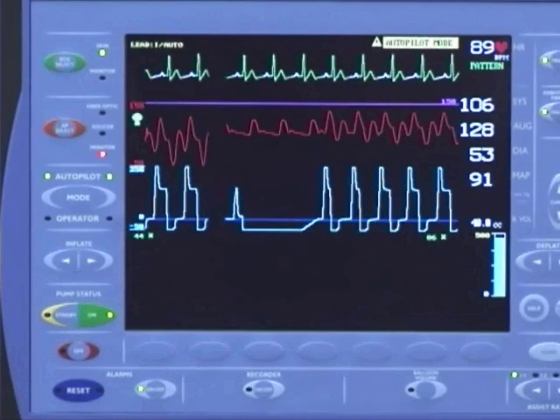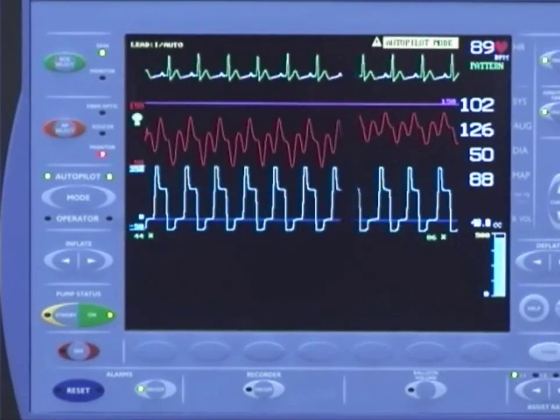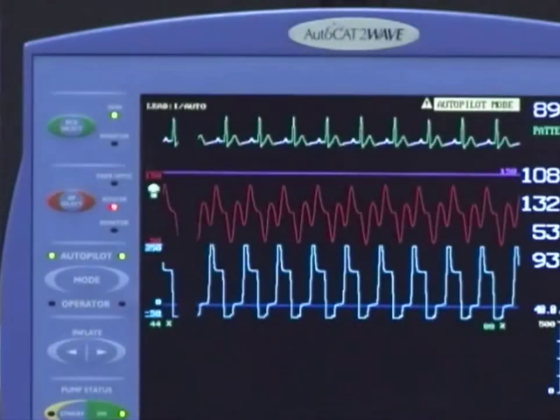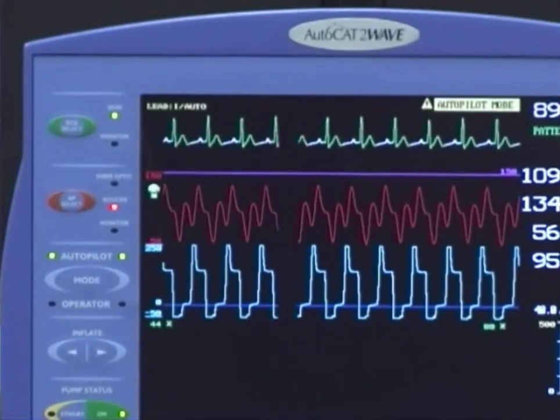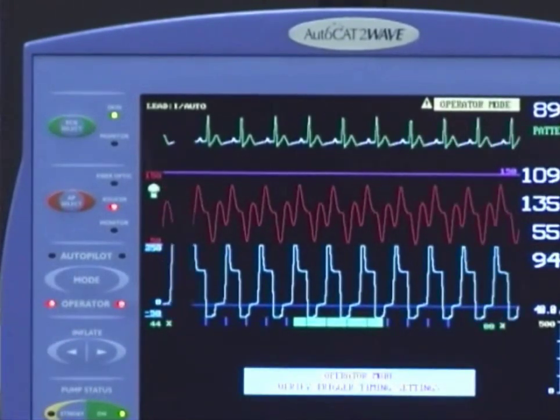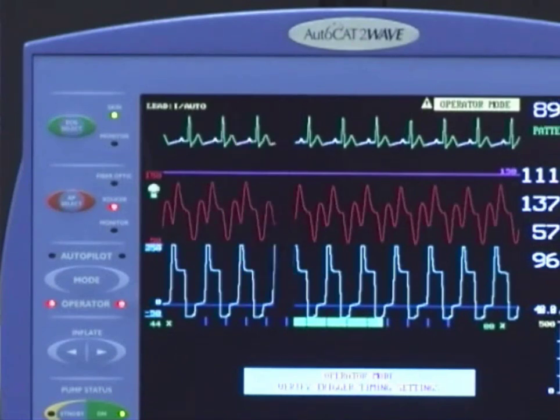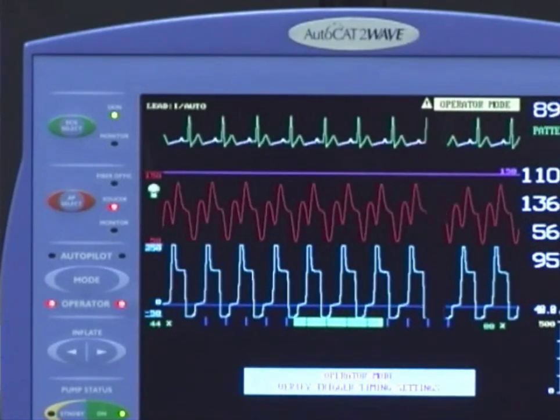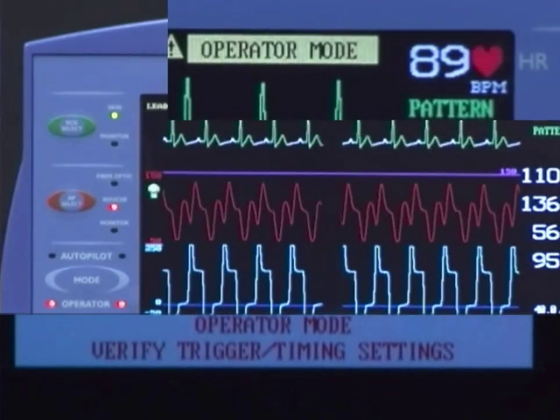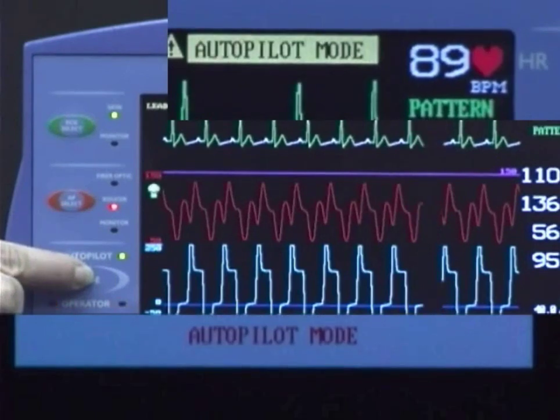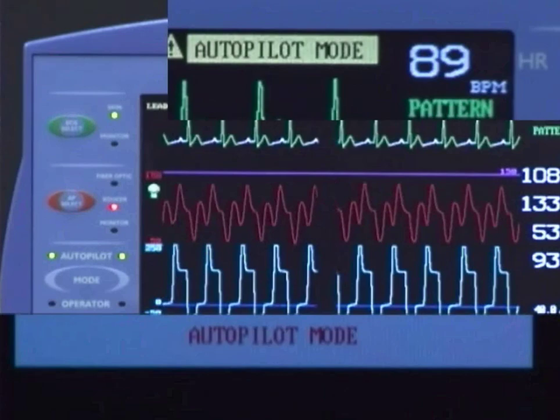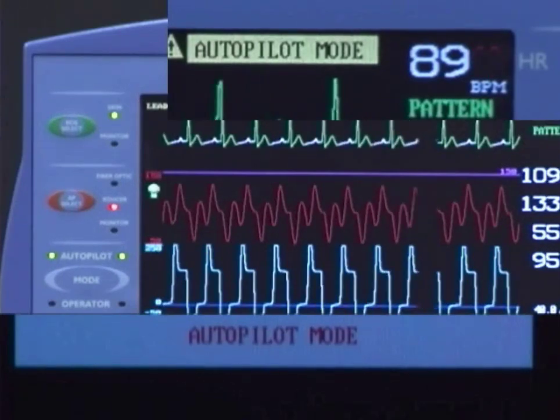Pumping begins at full volume, and timing is optimized automatically without user intervention for maximum patient support. While AutoPilot mode allows for worry-free, precise pumping of your patient, at any time during the course of therapy you can take control of the pump by selecting Operator mode. When Operator is selected, the LEDs by Operator will be illuminated and Operator will be displayed on the screen. When AutoPilot is selected, the LEDs by AutoPilot will be illuminated and AutoPilot will be displayed on the screen.